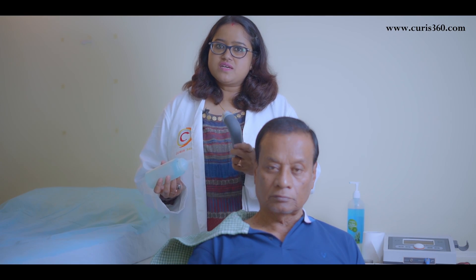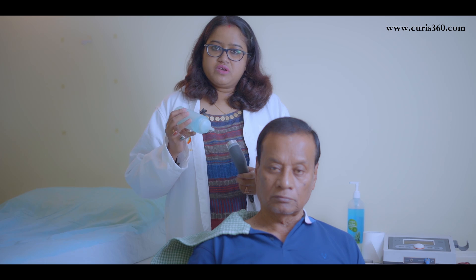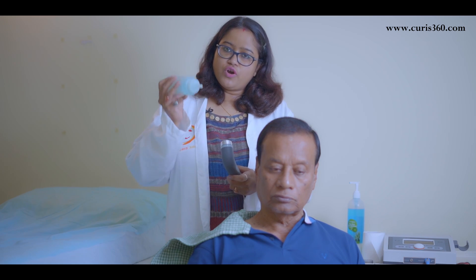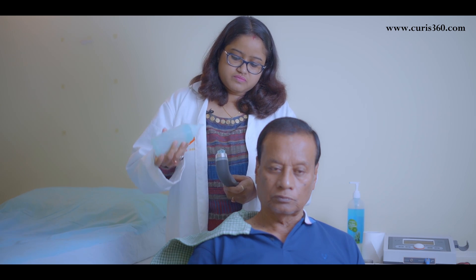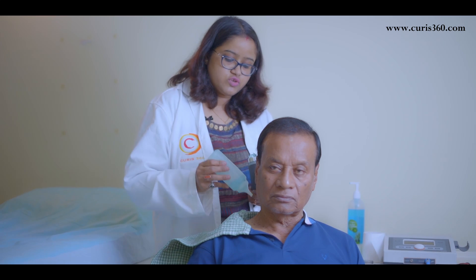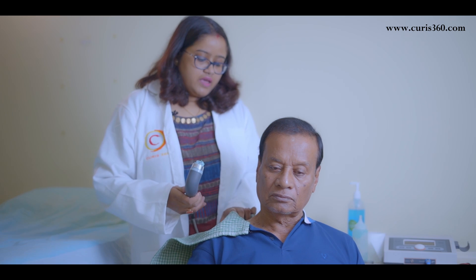We are going to perform this ultrasound on the patient now. We need a gel — a medium to transmit the ultrasound into the patient's body, because ultrasound cannot transmit into the body without a medium. For this we use an ultrasound gel specifically designed for ultrasound machines. We place the gel over the head, and if the patient's body is too dry, we can also apply a little on the patient's body.